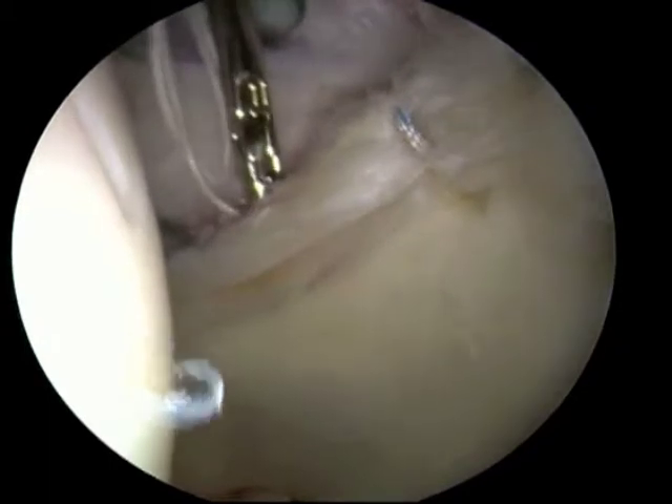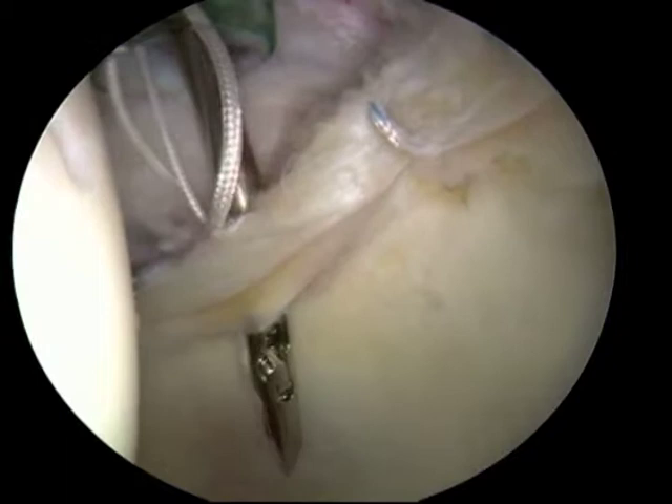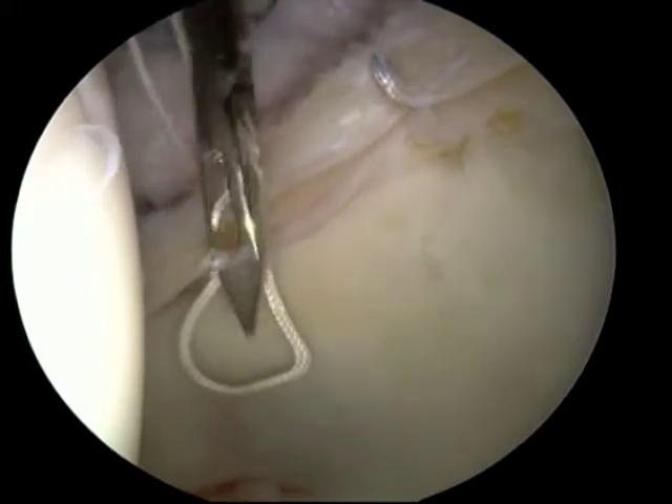The suture strands are pulled on initially to ensure that the anchor is well embedded in the bone and will not pull out. The sutures can then be passed either through the substance of the labrum, as is seen here, or around it.